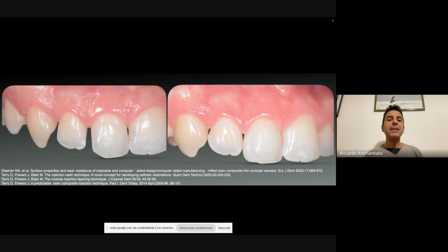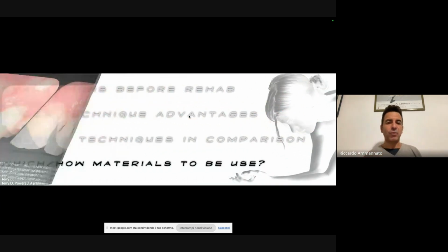And so you see here the situation before and the situation after. So again, we have here the canine, the mesiodistal on the lateral, and the distal side on the central. But this was just to share with you the differences between a full molding and a single molding, and we went through all the stuff.